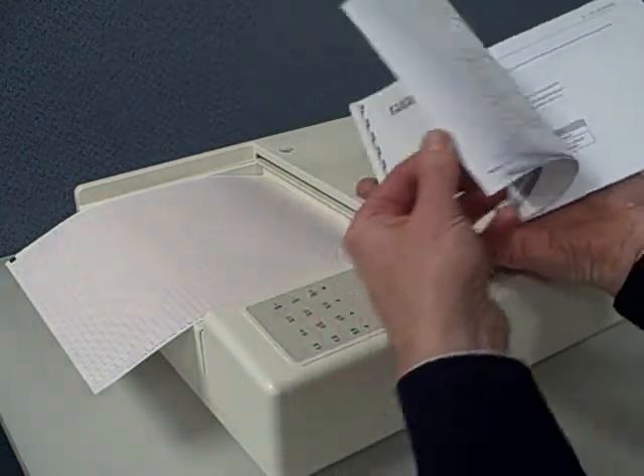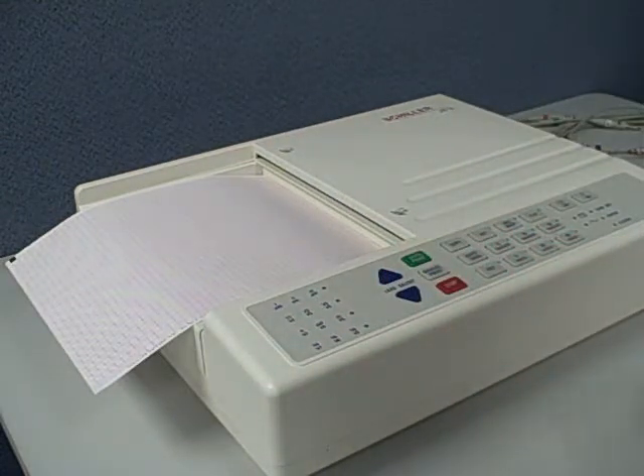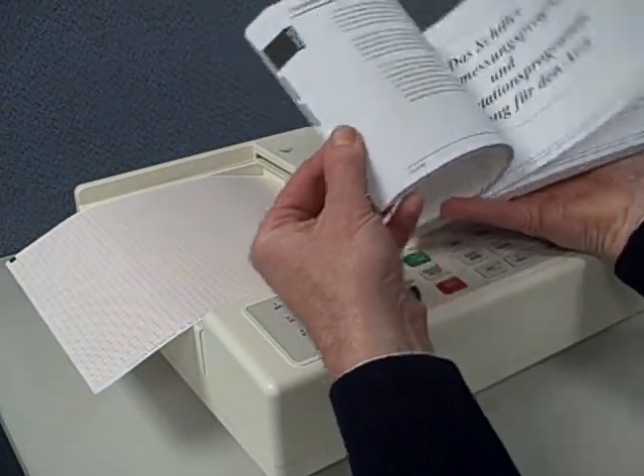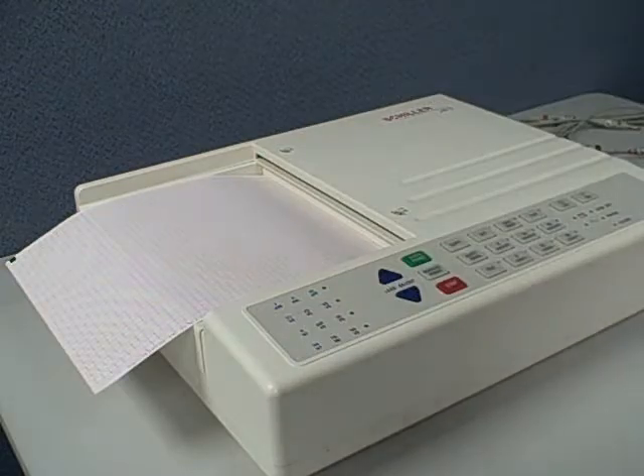It has a nice manual that gives you all the information you need about the machine. It also includes an interpretation guide in several languages, with guides to different types of arrhythmias.